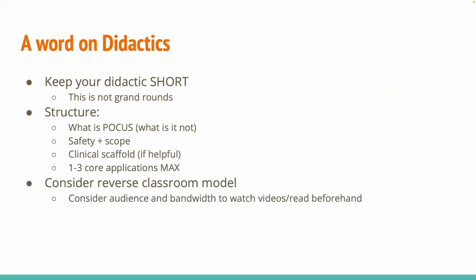You're still going to meet those goals of having them feel ready to try and scan after this workshop. So, like I've said already, keep it short, keep it simple. This isn't grand rounds. What is it? What is it not? Talk about your scope. You really want to emphasize that. And then a clinical scaffold, which I'll show in a couple of slides. And then you don't really want to go over 3, maybe 4 applications.